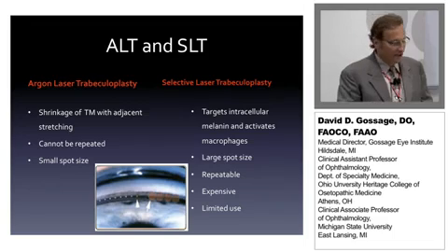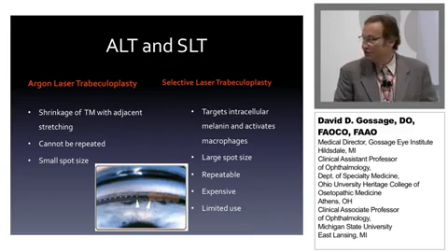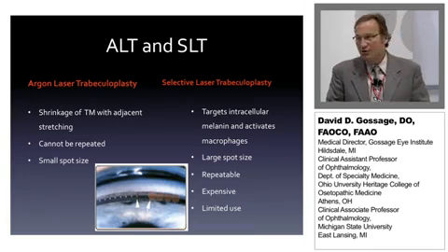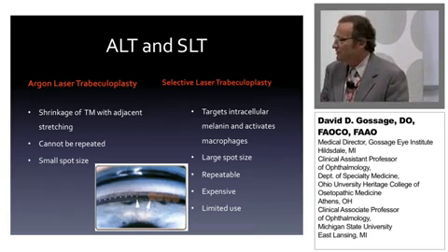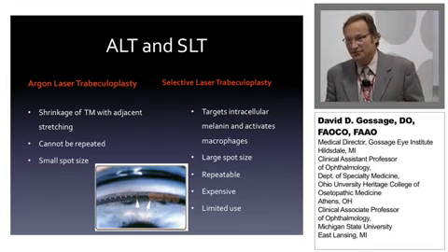When we look at selective laser trabeculoplasty, it targets the intracellular melanin and activates the macrophages. It uses a larger spot size. It is repeatable. However, the machine itself is relatively expensive, and it does have limited use in the fact that you can only use it for SLT.